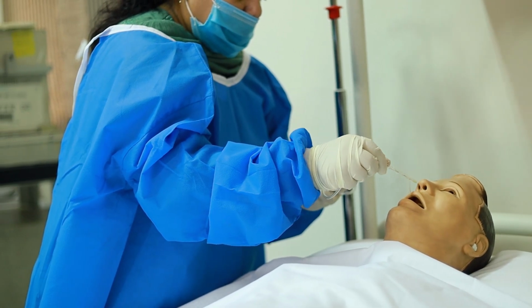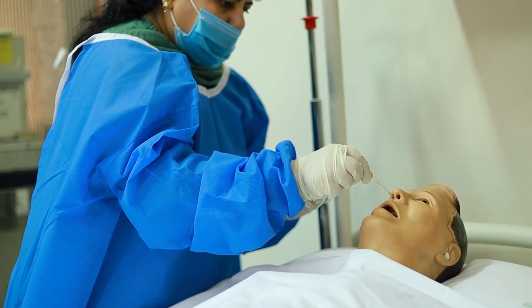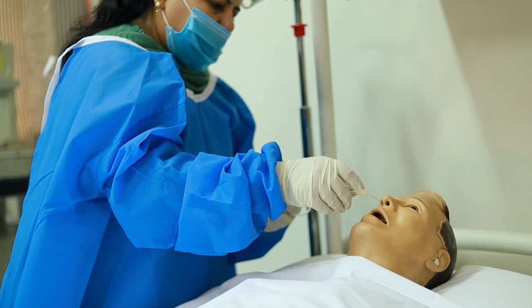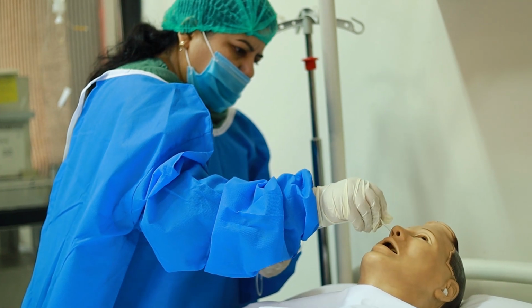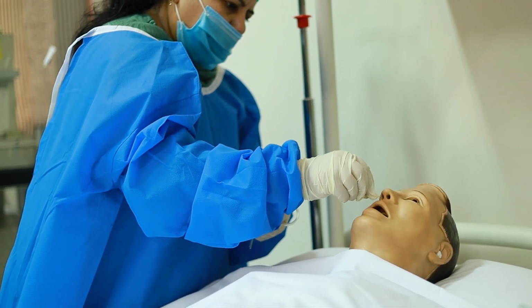Pass the tube via either nostril, past the pharynx to the esophagus and then to the stomach. Instruct the patient to swallow the tube. Mr. Ali, please swallow the tube.